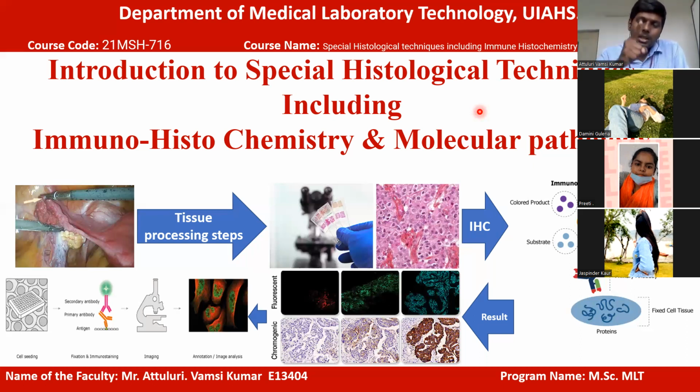This is the major limitation of immunohistochemistry. Immunohistochemistry can only tell how many proteins are present in the tissue, but it won't tell the functional status of those proteins. When I say protein, here enzymes. Immunohistochemistry cannot tell us whether these enzymes are functioning or not.